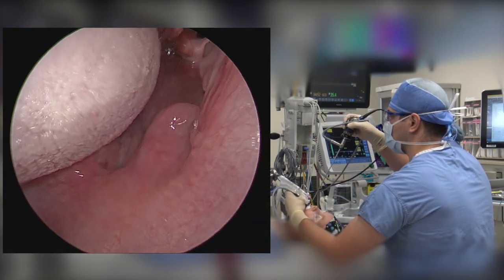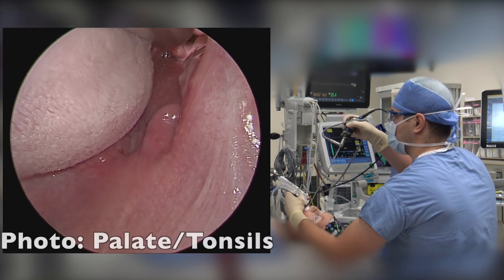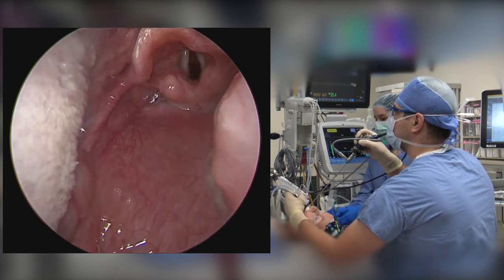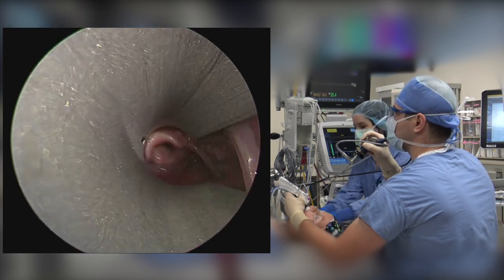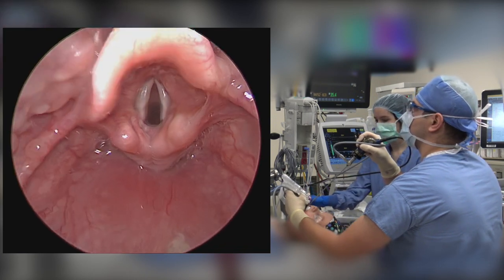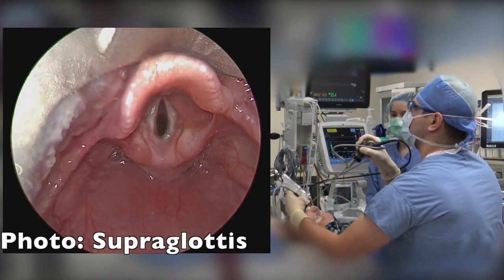A zero-degree Hopkins rod telescope is used to examine the structures of the airway. Also of note, we applied topical 1% lidocaine to the vocal cords at the beginning of the procedure to aid with anesthesia.